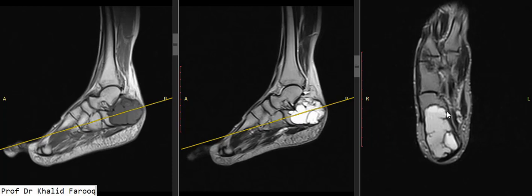calcaneum. It is basically an expansile lytic lesion with a very sharp zone of transition with adjacent normal bone, suggesting the benign nature of the lesion. We can also see multiple septa in it — here we can see multiple septa.